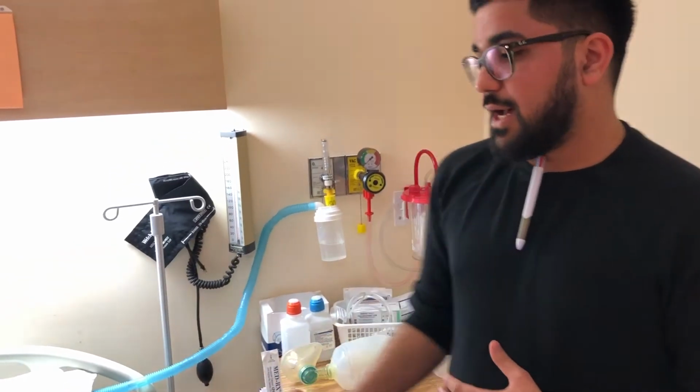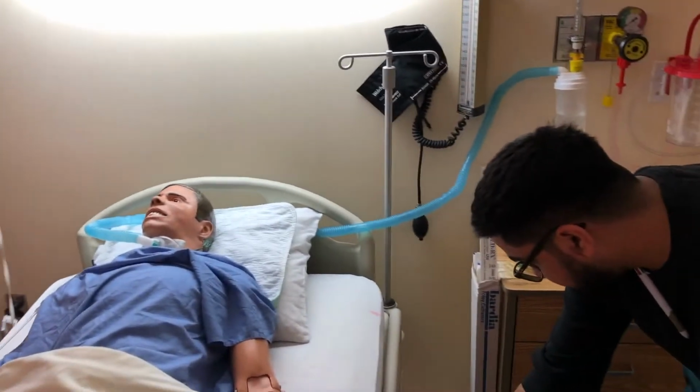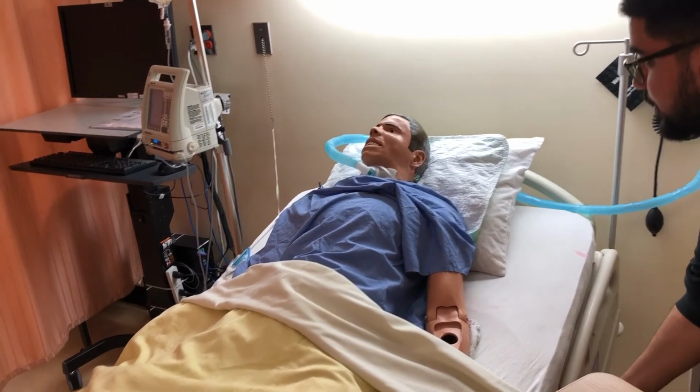We can also attach an O2 monitor throughout the procedure to monitor it, but we don't have an O2 monitor here, so for demo's sake, we're just going to say we do have the O2 monitor there. So I'm going to tell the patient, let's get into semi-Fowler's position here. There we go. I'll increase the height.